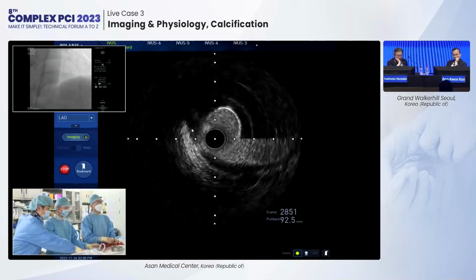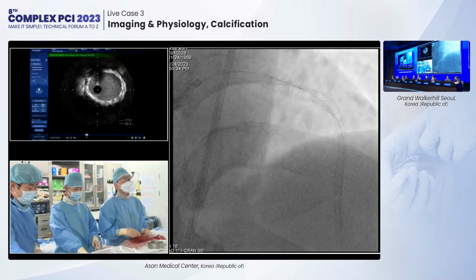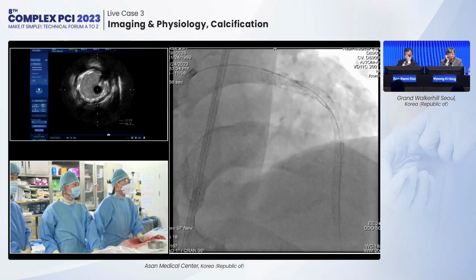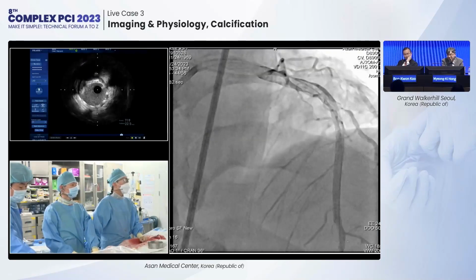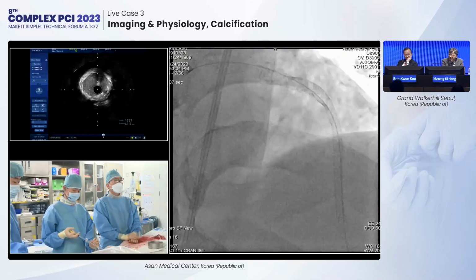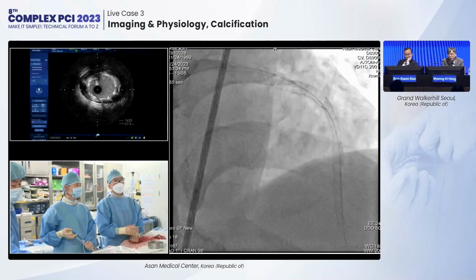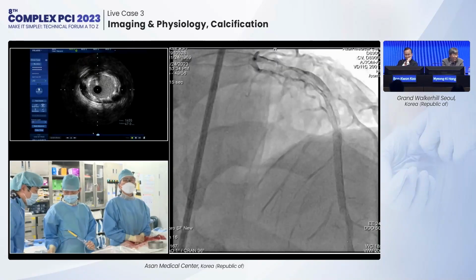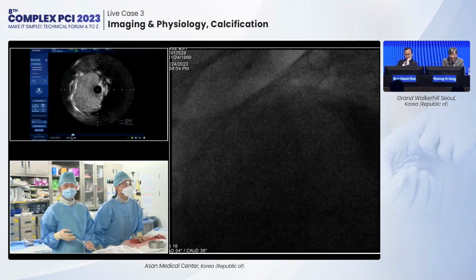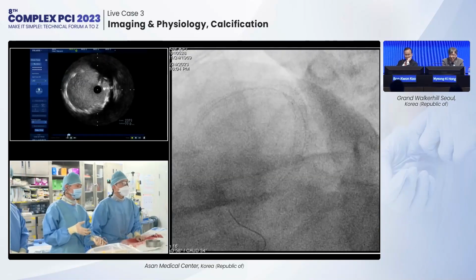Excellent. Actually, the angiographic appearance itself does not need the IVUS examination. Yes. It's too big a size. The only purpose of the IVUS in this patient is to evaluate the presence of stent malposition in the left main. That's it. Yes. Left main is huge. It's an excellent lesion. Can you please show the ostium of the proximal LAD? And I will check the spider view. Angio?